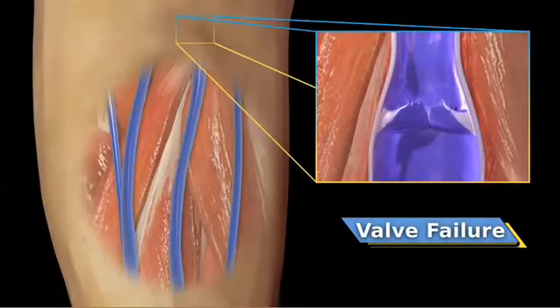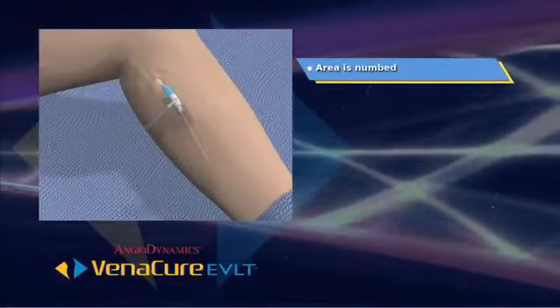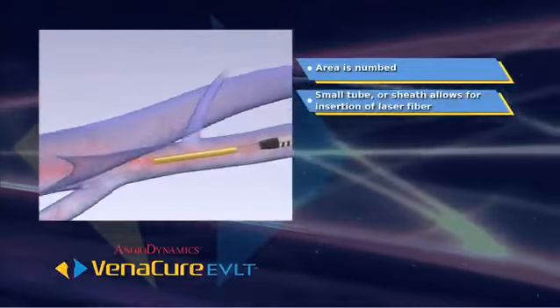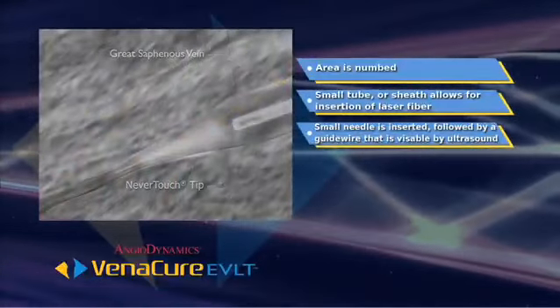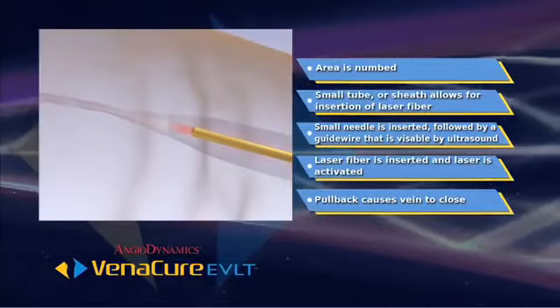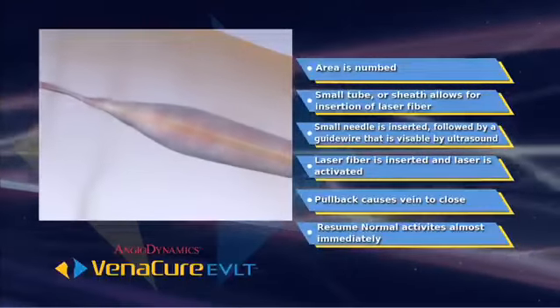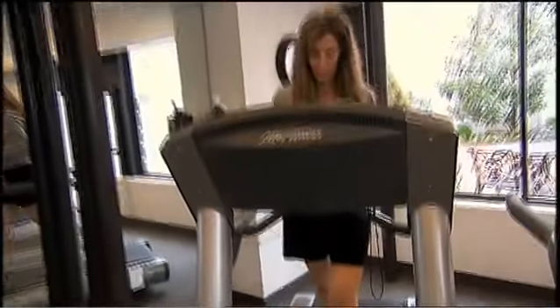So how does a laser work to fix this problem? All it requires is local anesthetic, just to numb the area up, and a tiny little skin nick that doesn't even require any sutures. You just pass a little laser fiber into the vein and you use ultrasound to visualize the little laser fiber and position it precisely. And once you turn on the laser energy, you can ablate, meaning close down the vein thoroughly, and that's all done in less than an hour without any significant discomfort or anesthesia. And people leave the office with usually a compression stocking on and are encouraged to resume all their normal activities immediately.